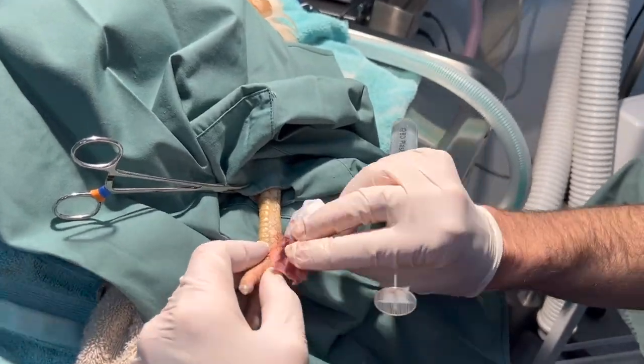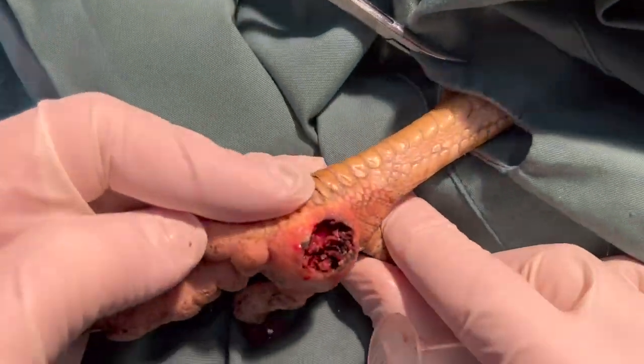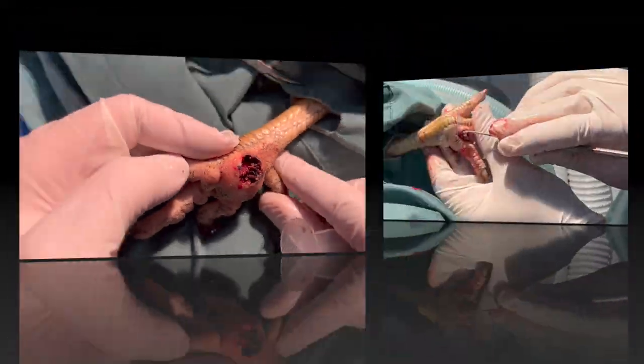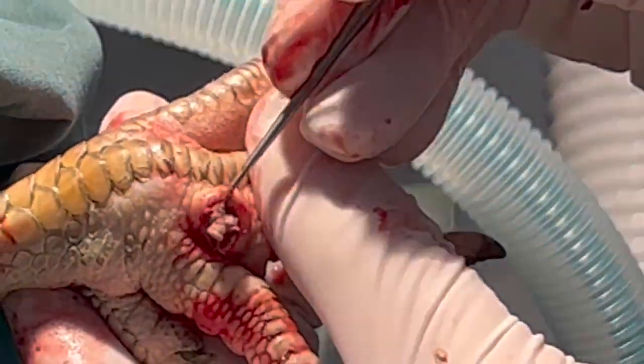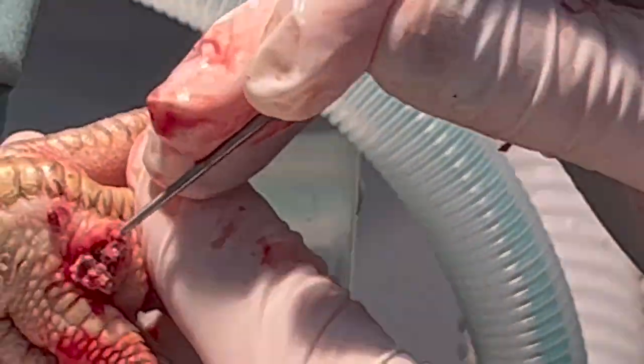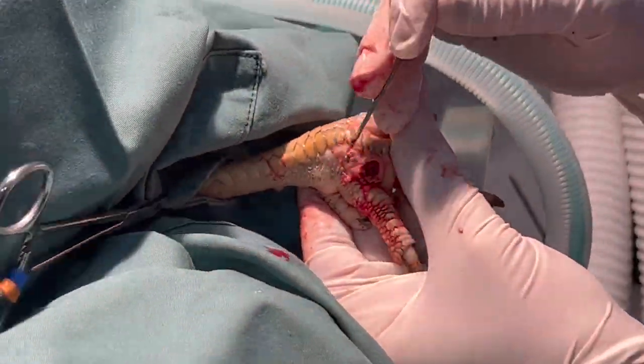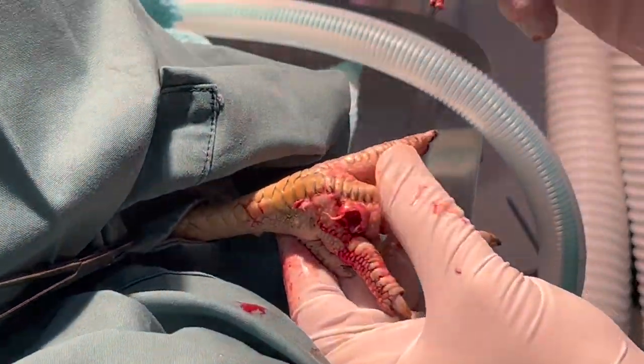You can see the local anesthetic works very well. Can you see it coming up? You can really see the pussy, yucky material. Let's just get some gauze ready here just in case it bleeds.